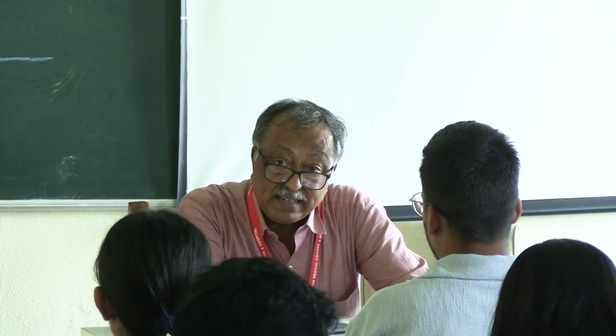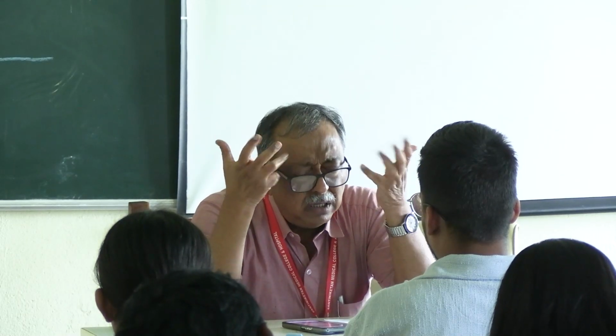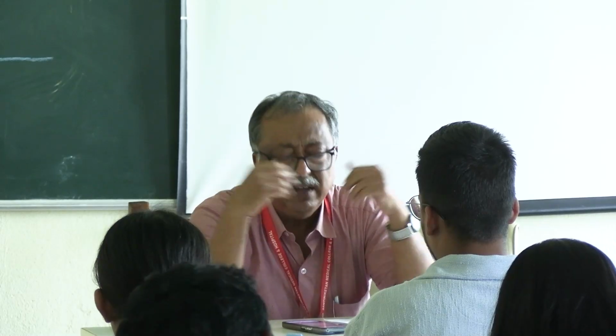Generally there are three tuning forks in our clinic, on the tray. One is the 128, second is the 256, and there is the 512, sometimes 1024. But we prefer 512. Why?